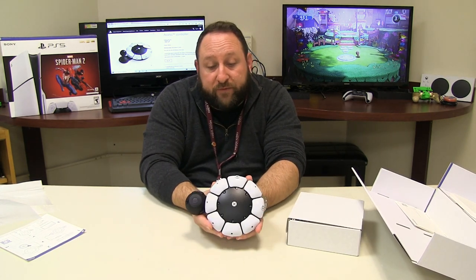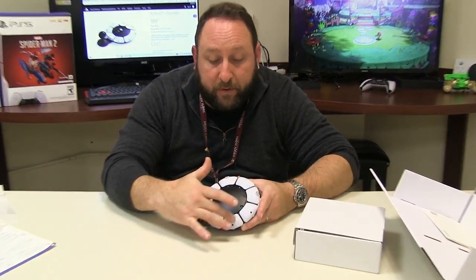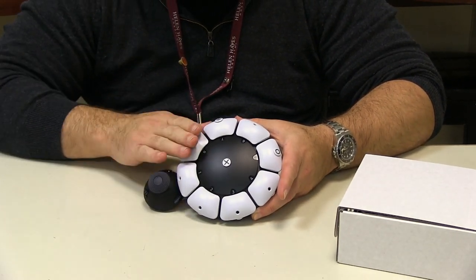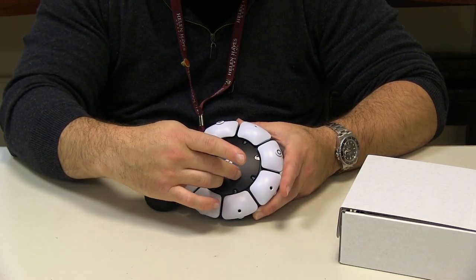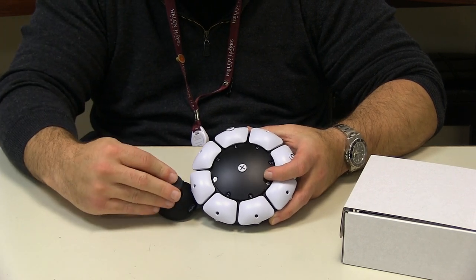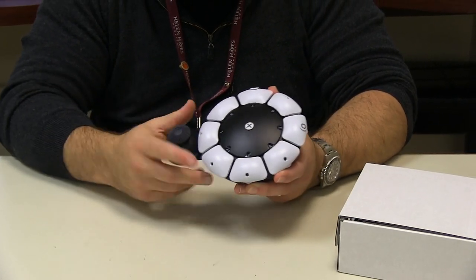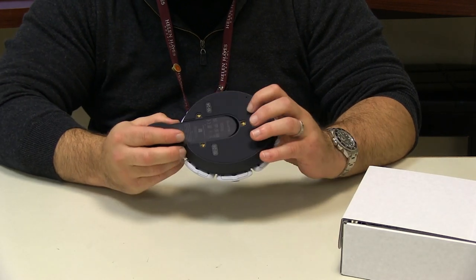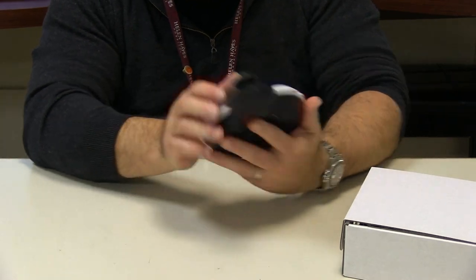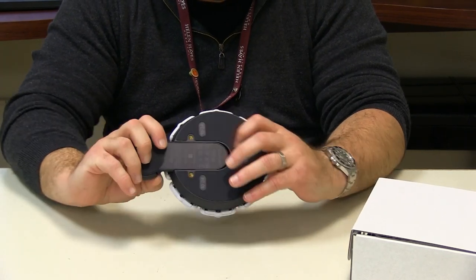We're going to give a quick overview of what we have here. We have eight buttons that are programmable — programmable to toggle or work on a hold press. There's also an additional button here in the center. A joystick with different joysticks that you can add on, in different shapes and sizes. The joystick arm comes in and out so you can be at an appropriate place for your comfortable level of play. We have mounting tabs on the bottom in case you want to put it on a gooseneck, so it's always in the same position.